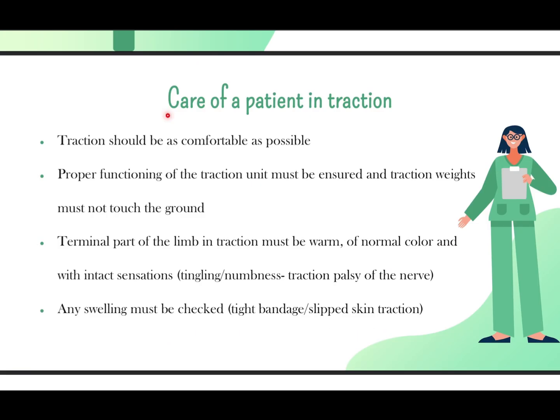How do we take care of a patient in traction? Traction should be as comfortable as possible for the patient, as the patient needs to be in traction for a long time. So the patient's comfort should be the priority. Proper functioning of the traction unit must be ensured, and the traction weights should not touch the ground, otherwise it does not serve its purpose.